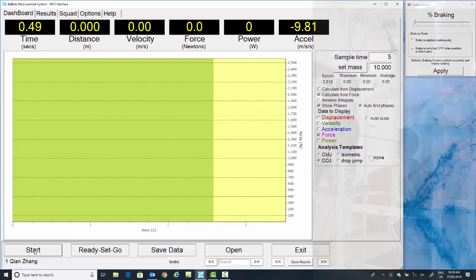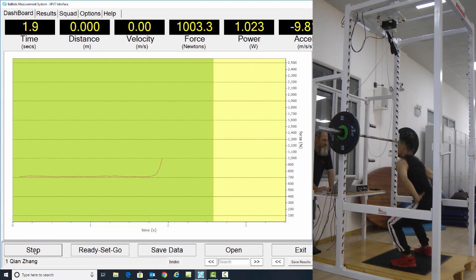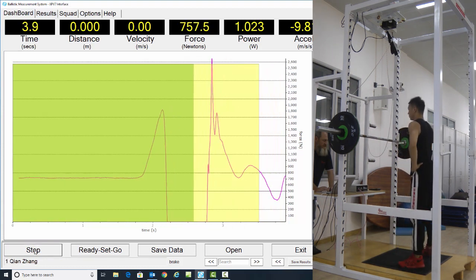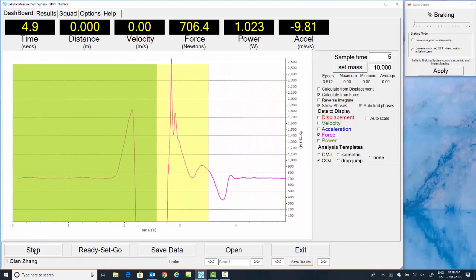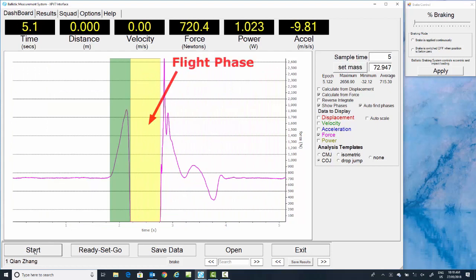In a concentric only jump, in this case we're going to do a squat jump. You can see that after data collection, you have the concentric phase and the flight phase automatically detected.